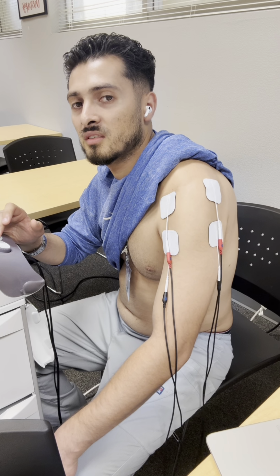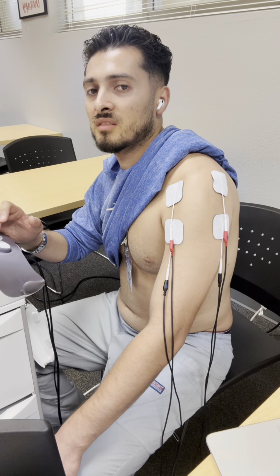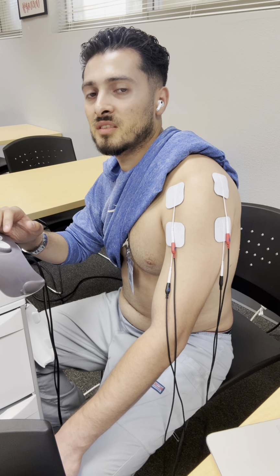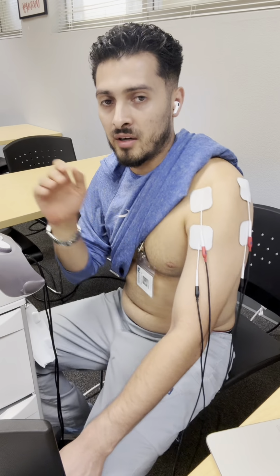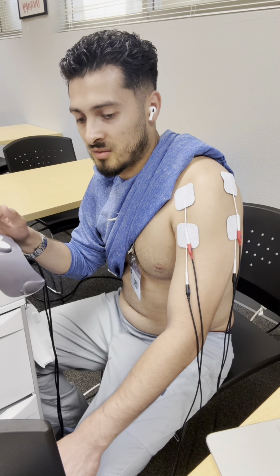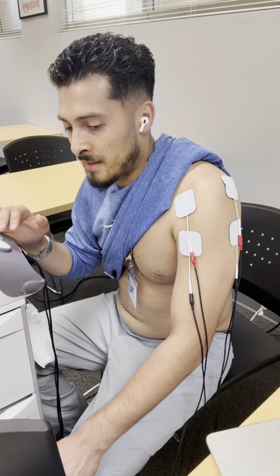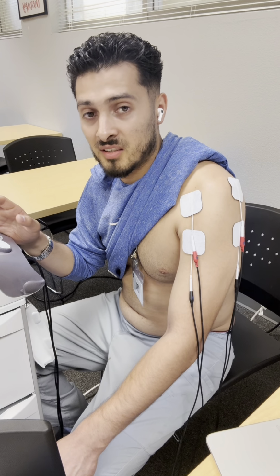There's 13 intensity. Probably wouldn't go more than that. It's an even blend of muscle contractions and buzzing, tingling sensation. And it's going to be continuous. There's no on and off time that goes on with this. So it stays continuous. The ramp time doesn't happen either. You're going to feel that right away. As far as the amplitude, you just want it to be a comfortable tingling sensation.